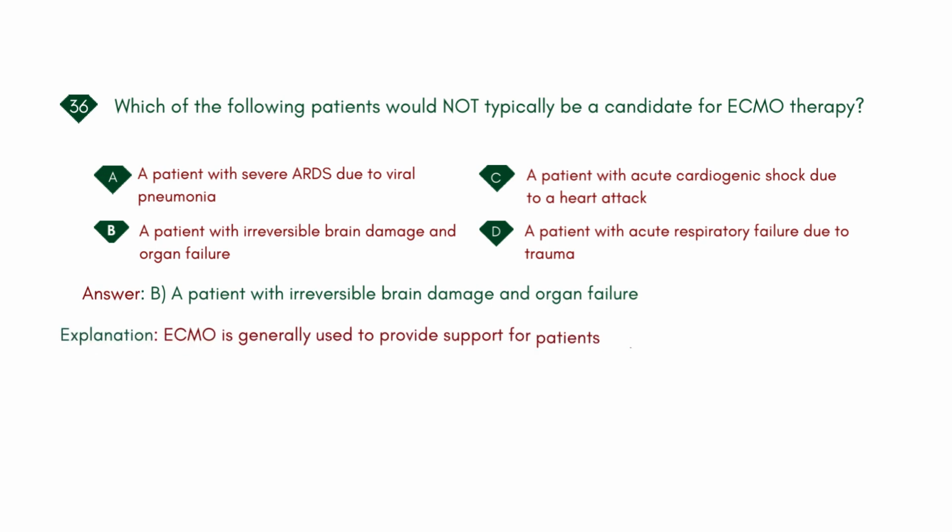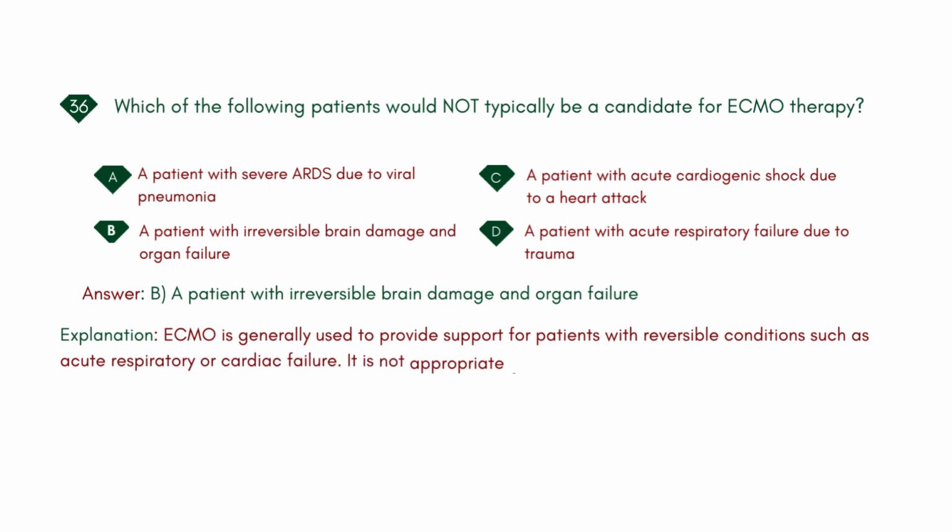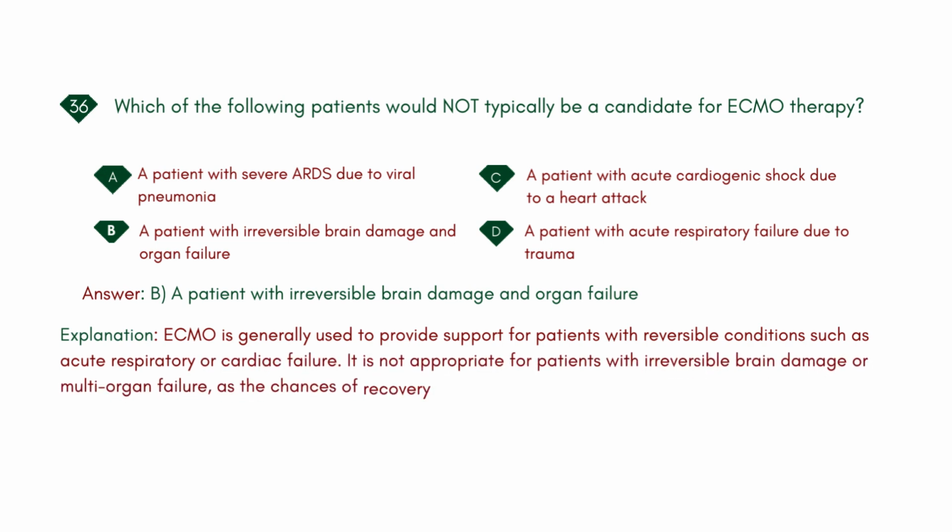Explanation: ECMO is generally used to provide support for patients with reversible conditions such as acute respiratory or cardiac failure. It is not appropriate for patients with irreversible brain damage or multi-organ failure, as the chances of recovery are minimal, and ECMO would not improve outcomes in such cases.